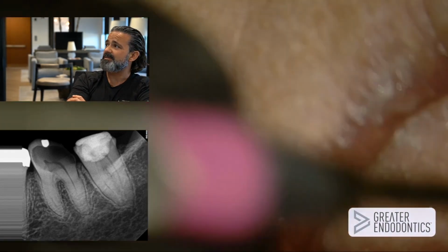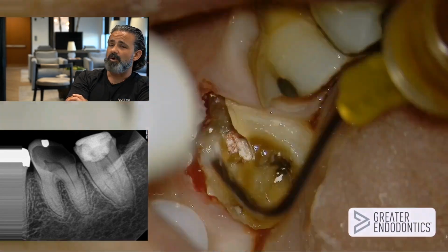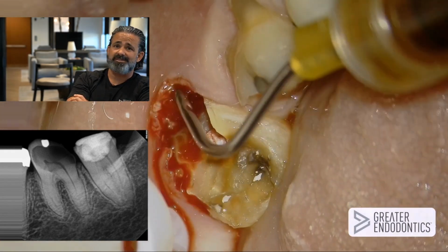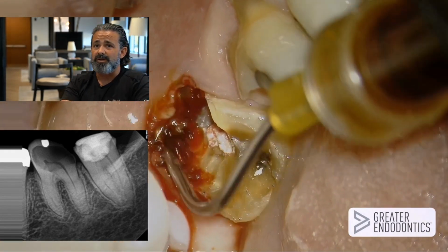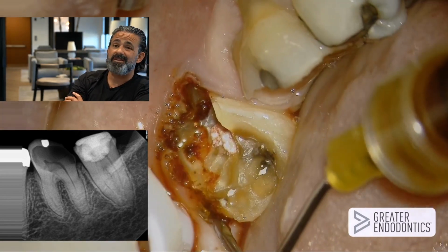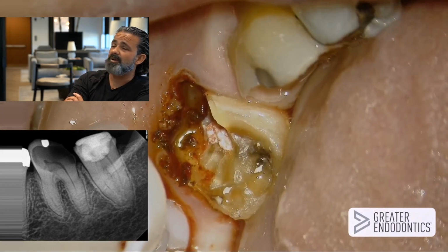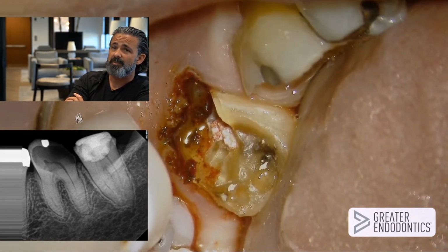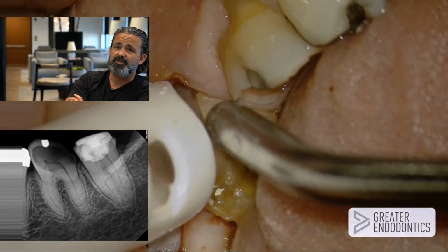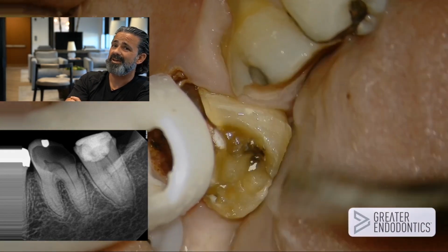You know it is, but it's a very useful, important tooth in the strategy. So I'm going to take some astringent X and just burnish that into the gums and just chemical cautery right now. That's what's going on, and to control the bleeding. And then I'm going to give it another attempt of isolation. And you know what? I think that's the thing we all have to decide. Would we really compromise this first step? And for me, I'm going to go to that degree of stability. And if I don't, that's when I kind of deem it non-restorable.